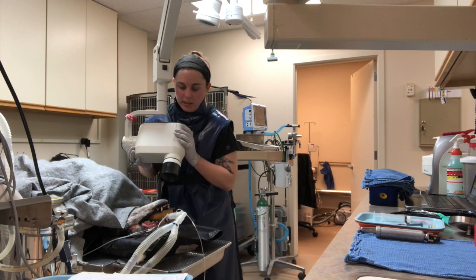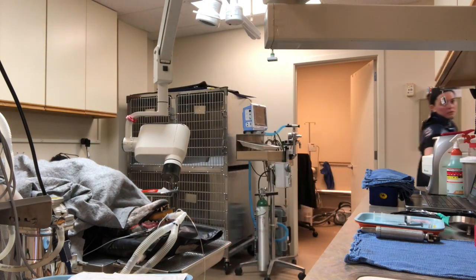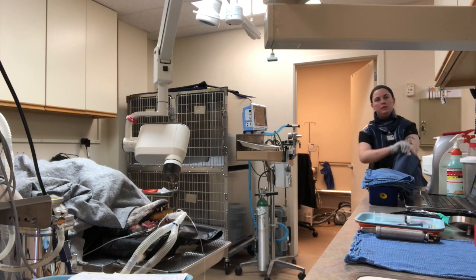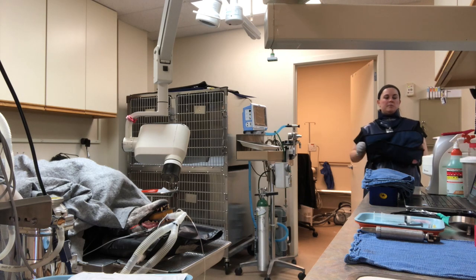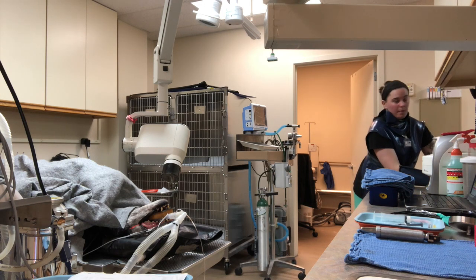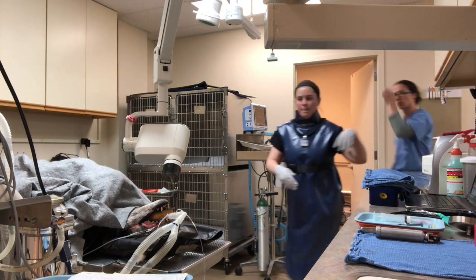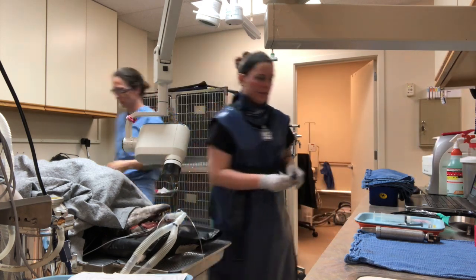So I know I'm going to collect it all on my plate. Again, PPE, X-ray. Run that and see how it looks.